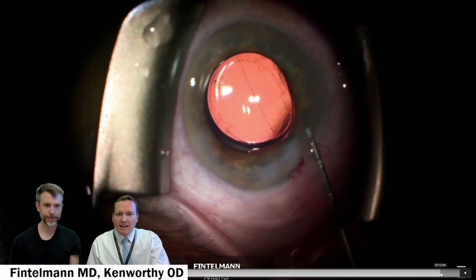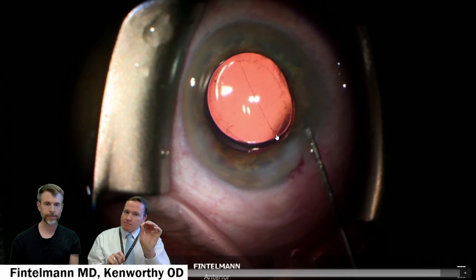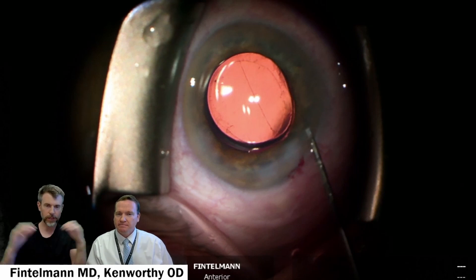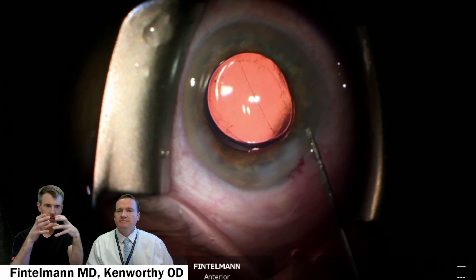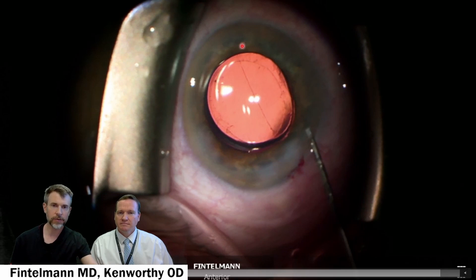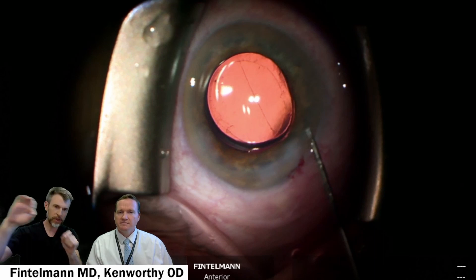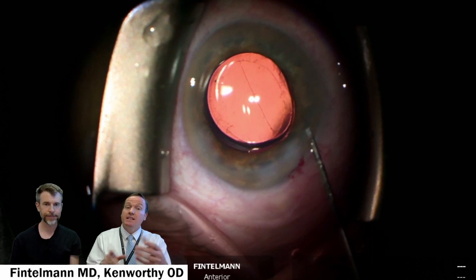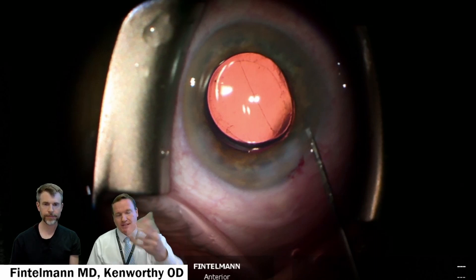I have to ask one more question. At the end of this video, I noticed this little hairline line right there — I'm assuming that's the capsule being stretched just a little bit. The normal lens is about 9x4mm in its biggest dimensions. The new lens is maybe half to 1mm thick and 6mm in the optic. That little fold is the connection where the haptics are — the haptic goes in one direction and then the other, putting the capsule under a bit more stress, creating a fold that will go away in the long run as the capsule shrink-wraps around the new lens. We can see those little stretch lines of the capsule in post-ops at one day, one week, even a month — not uncommon, and we can see it right here at the time of surgery.